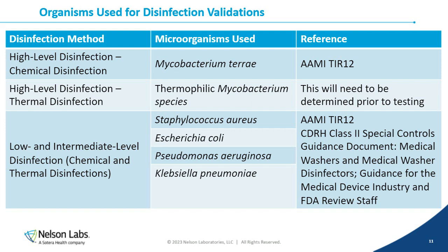I will say, if you have not reviewed AAMI TIR 12, I would highly recommend that as you prepare for any disinfection validation, that you review that document. It has a lot of great guidance in there and can help you understand what really your device needs.